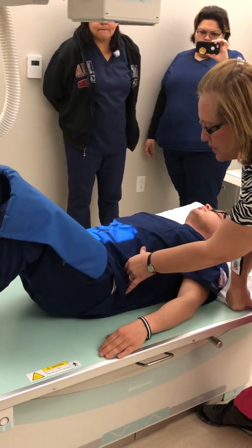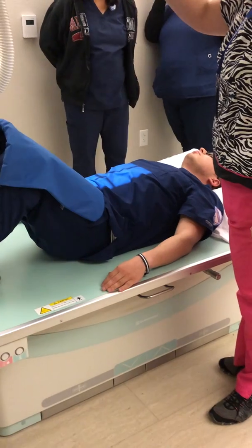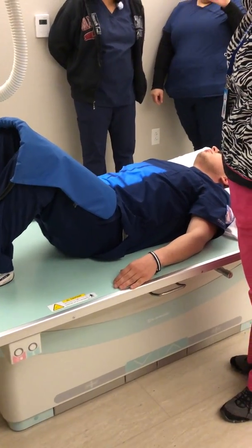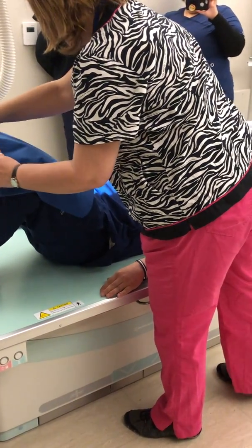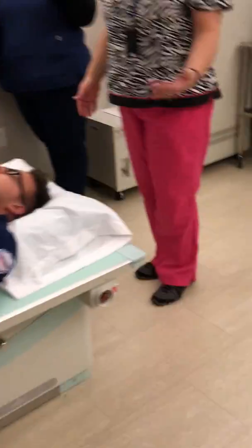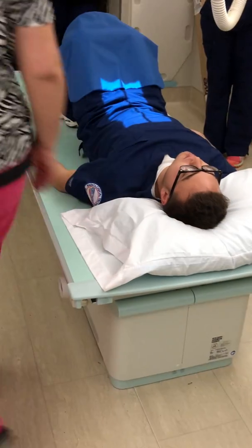Okay, so lumbosacral seems to be pretty common. They collimate out to the 17-inch field of view. Just going to be right in there somewhere. I'm going to adjust my shielding out just a hair. Make sure, nope, patient's not in alignment there. I'm going to have you scoot your hips over just a bit. So from the head of the table, the patient is in alignment.